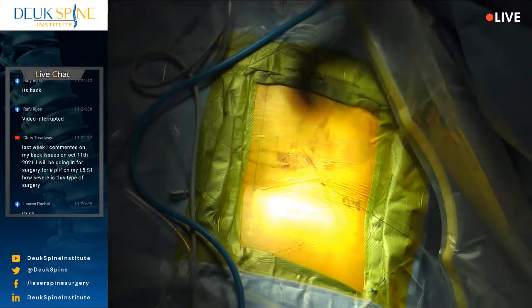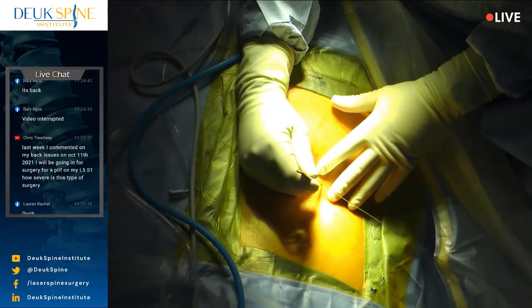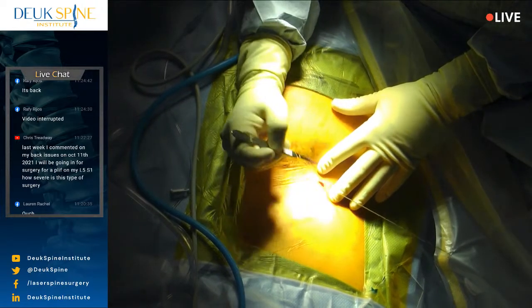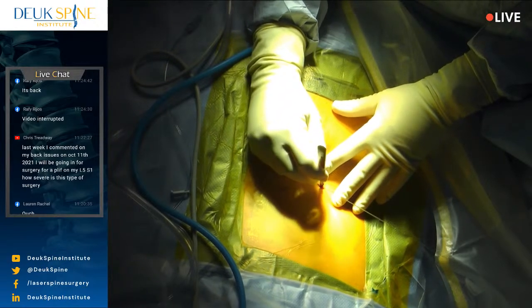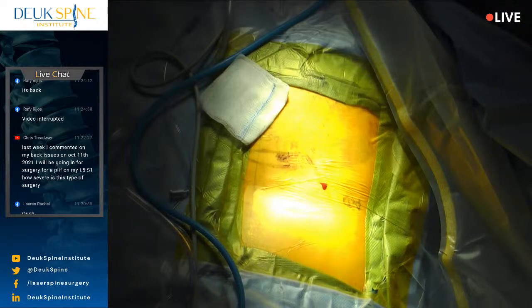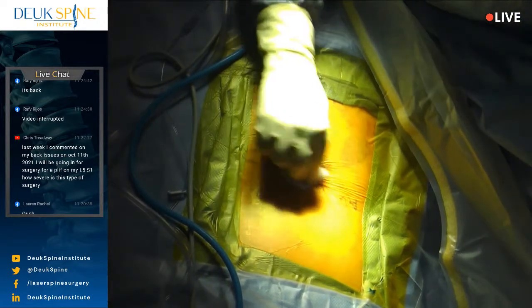She asleep? We're going to make our incision. The whole surgery will be done through a 7mm incision. Okay, 7 millimeters, no bigger. It's a 1/4 inch, basically. And we'll lose probably a drop of blood, maybe a few, but usually not more than a couple of drops of blood.